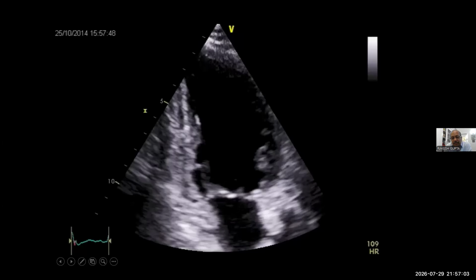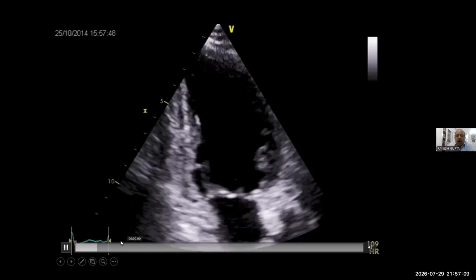What will happen with M-mode? Coming down to your question, Satyam. How will you draw your M-mode in this segment of the two chamber view? Draw a line, segment to segment wise. So just try to do it tomorrow.